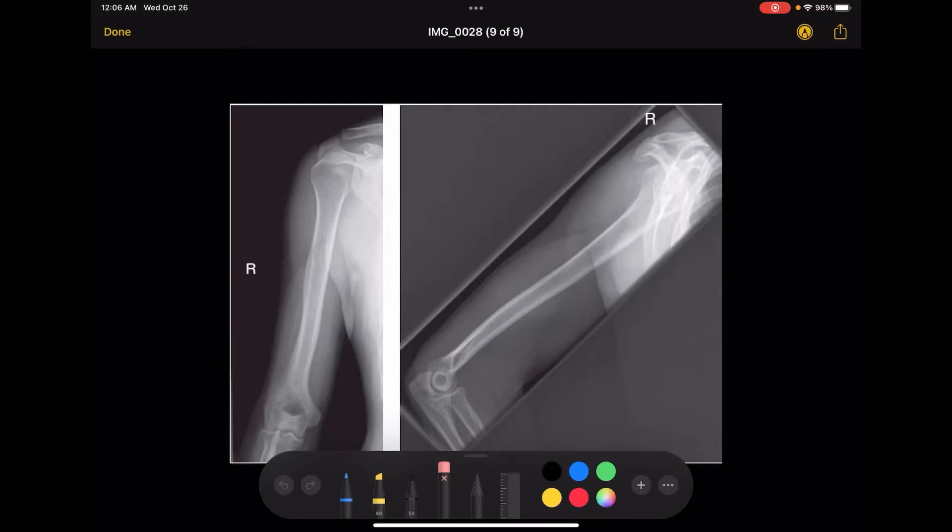This video is going to be an image evaluation of a humerus x-ray. The humerus x-ray has two views normally: the AP and the lateral. You want to include two inches above the shoulder joint and two inches below the elbow joint for both the AP and lateral.